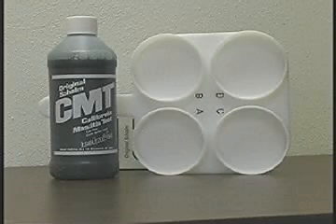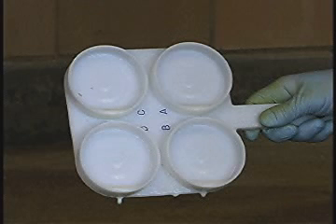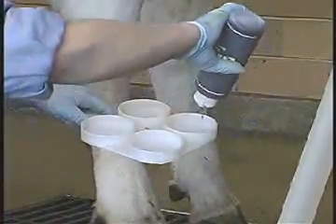The CMT solution should be properly reconstituted according to package instructions. About 1/2 teaspoon or 2 cc's of milk is taken from each quarter. This is the amount that would be left in the cups when the paddle is held nearly vertical or in an upright position. An equal amount of CMT reagent is added to each cup in the paddle.